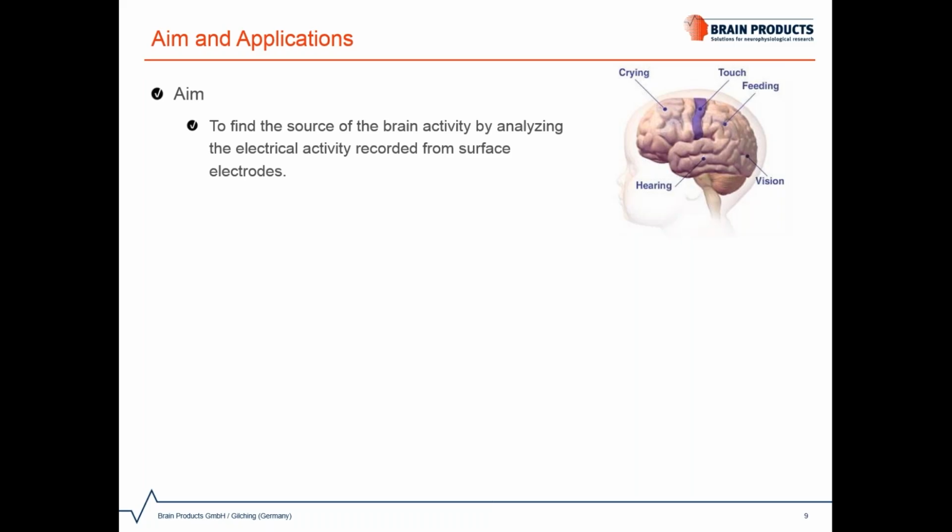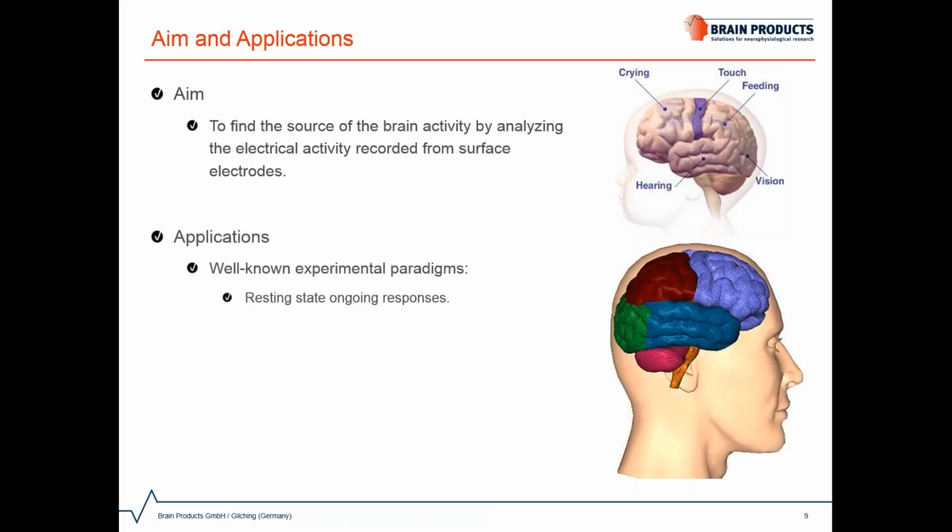It helps you to map brain regions responsible for a specific function and behavior. For example, right now, if I stop talking, the areas at the back of your brain called the occipital lobe, and specifically your visual cortex, will be highly activated while you are reading the sentence in the slide. Some applications in which source analysis has contributed to scientific and medical research include the state of eyes closed at rest, generating the alpha waves, which has been shown to be dominant over the posterior regions.